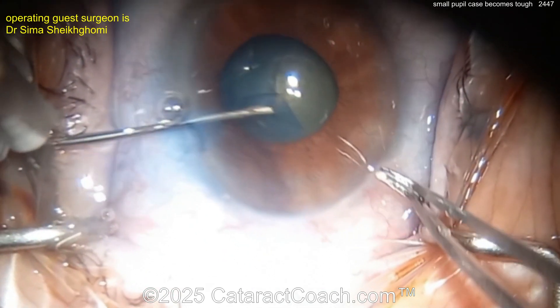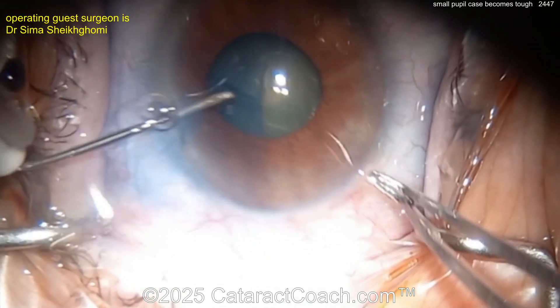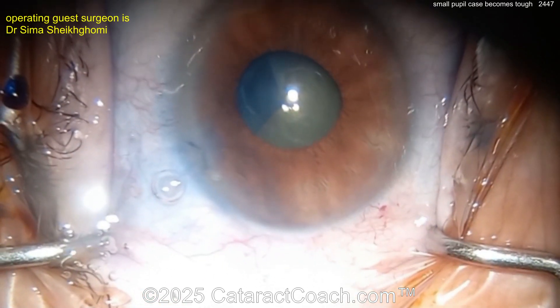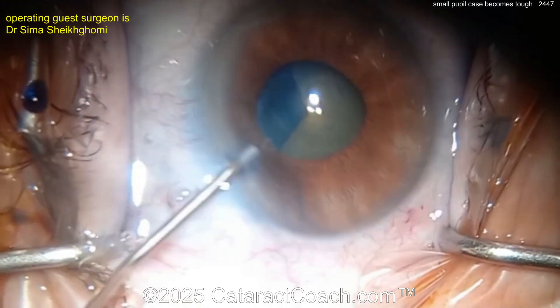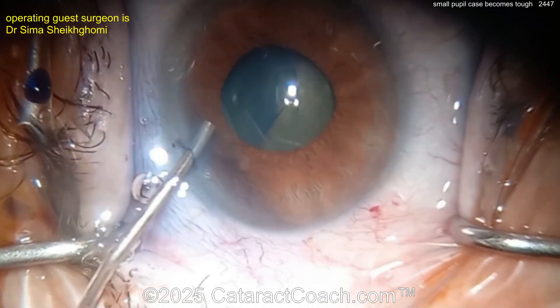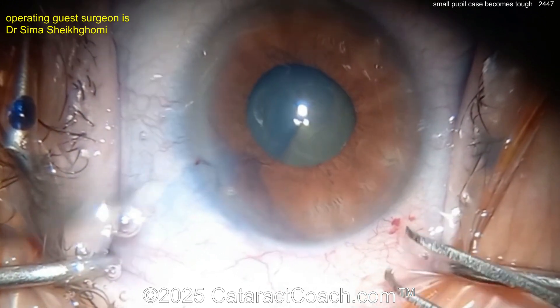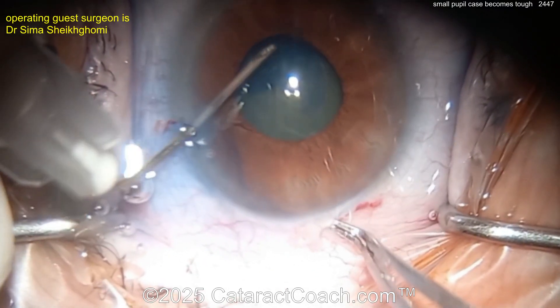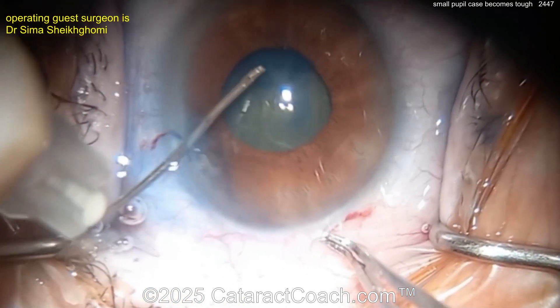Very nicely done, but the rhexis is kind of small — not great dilation here. This looks like a baby rhexis, at best a four-millimeter rhexis. I need a lot more than that. A small rhexis is going to make your life tougher, but if that's your technique that's okay too.